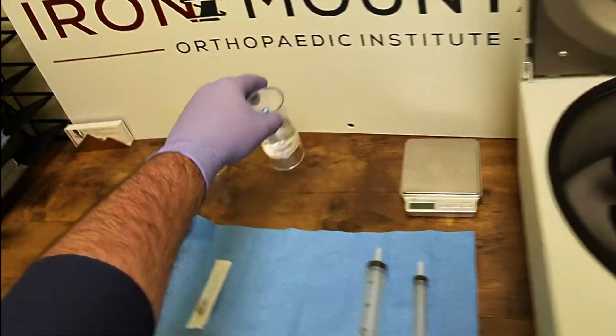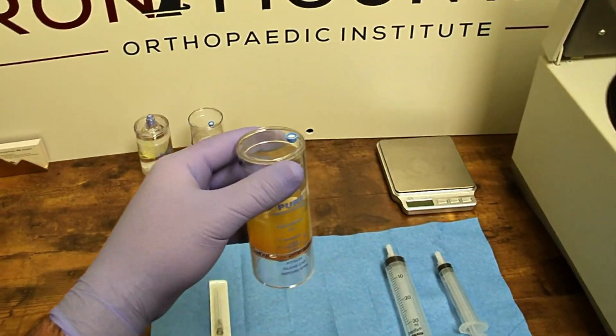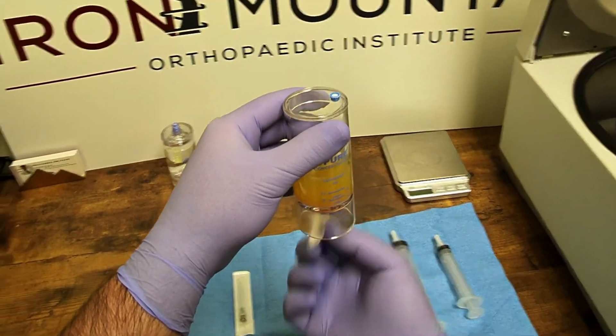Once the spin is complete, you can see the platelet concentrate buffy coat is separated out at the bottom of the concentrator device, with the platelet poor plasma at the top.